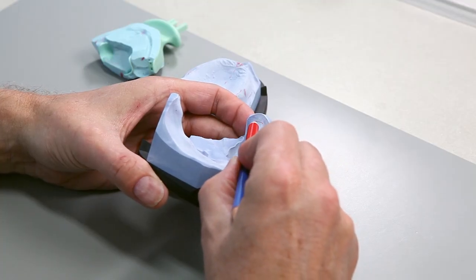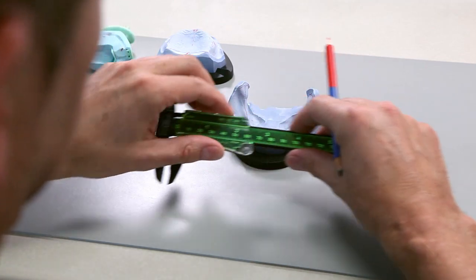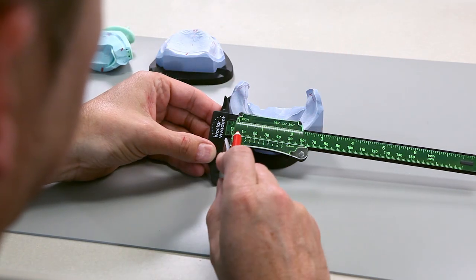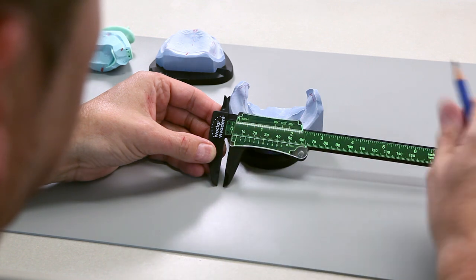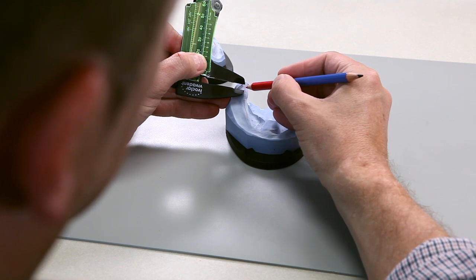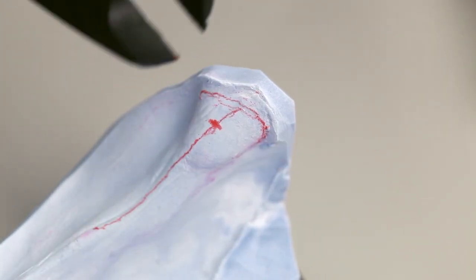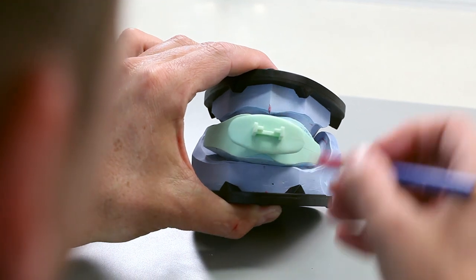Mark the dorsal end of the retromolar pad. For the alignment of the occlusal plane, bisect the two retromolar pads. Often, the whole pad cannot be identified clearly. However, experience has shown that the occlusal plane is situated approximately 5 mm below the dorsal end.